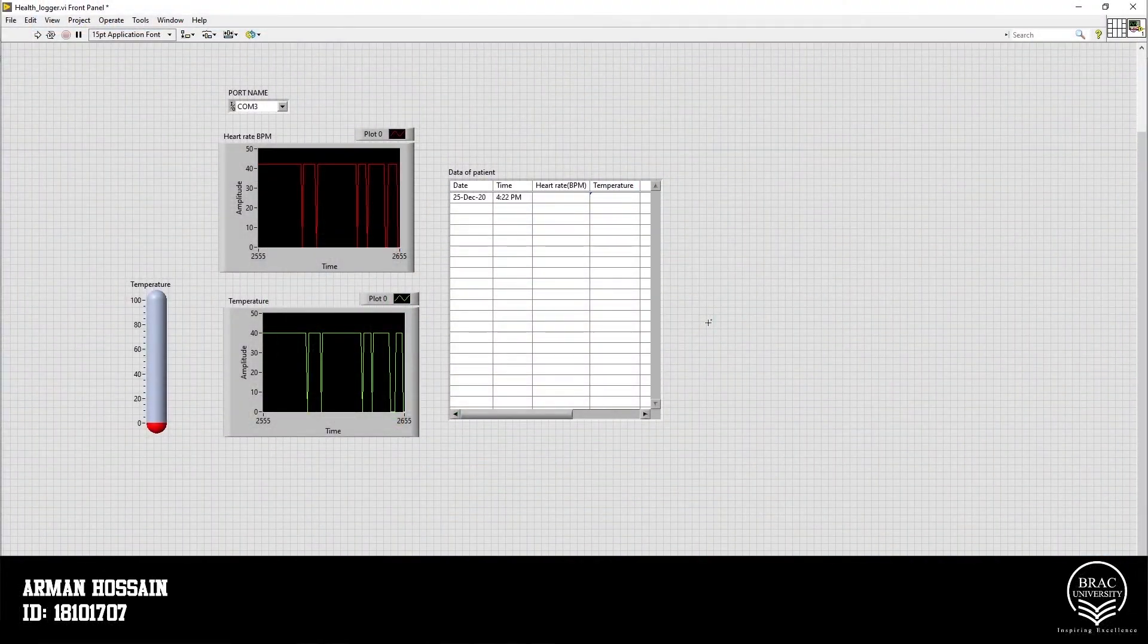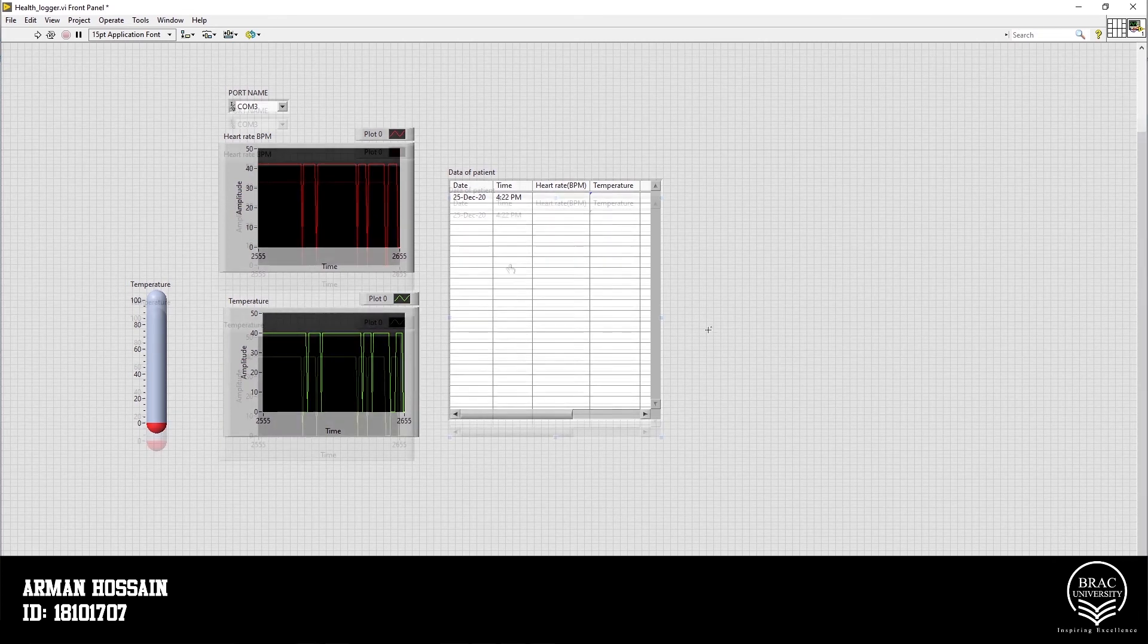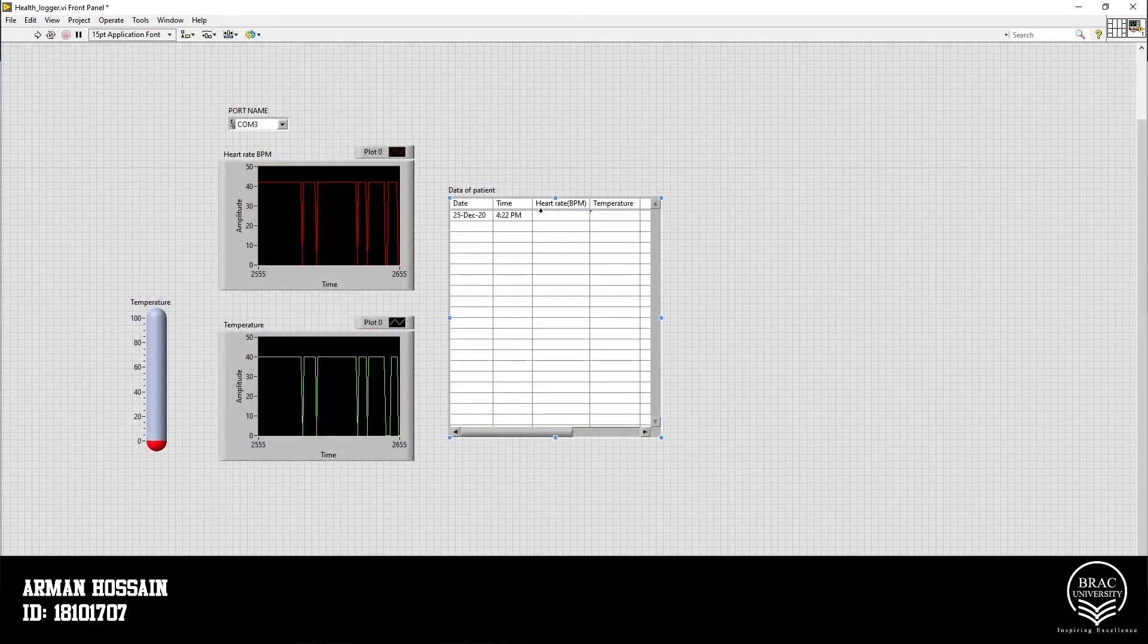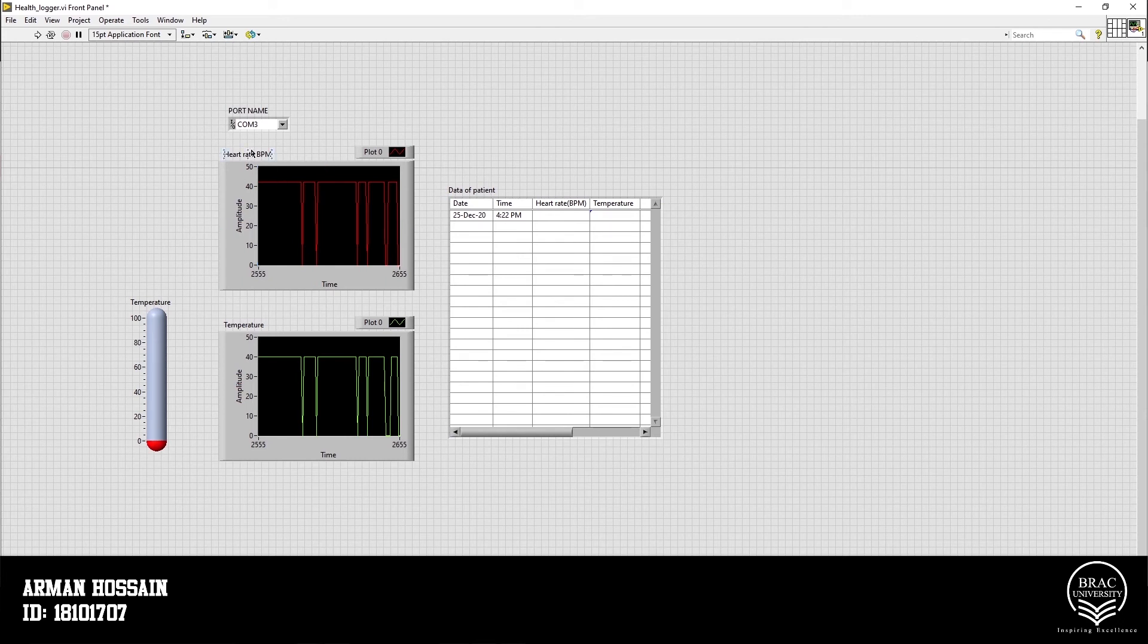Hello, I am Ramanu Sen. Now I am going to explain the LabVIEW part of our project. And in this table, our heart rate and temperature data will be logged. And graphical representation of heart rate and temperature data will be shown in these two graphs.